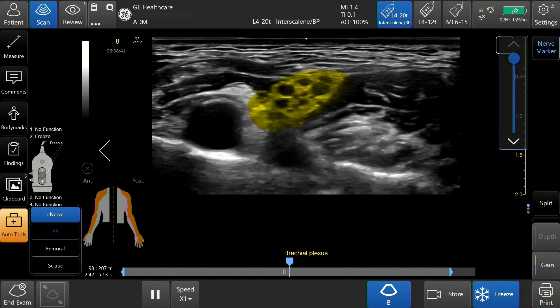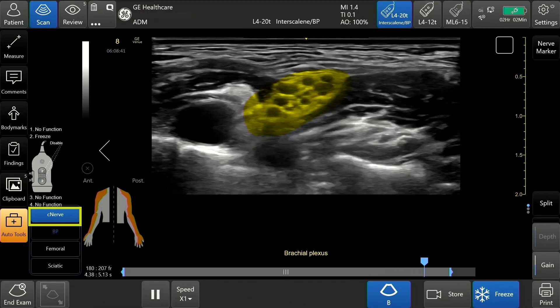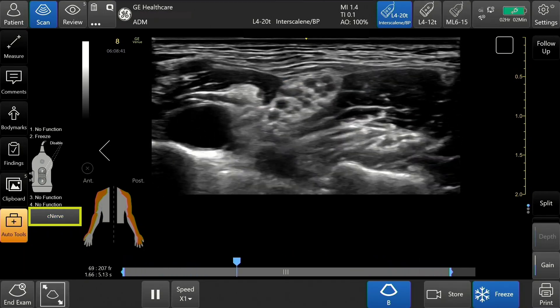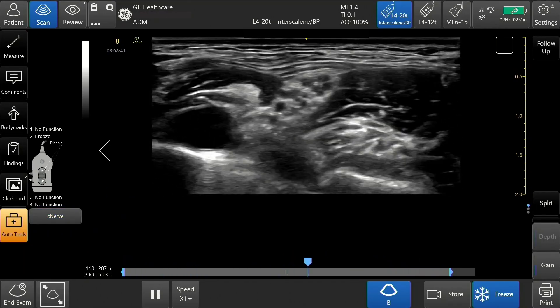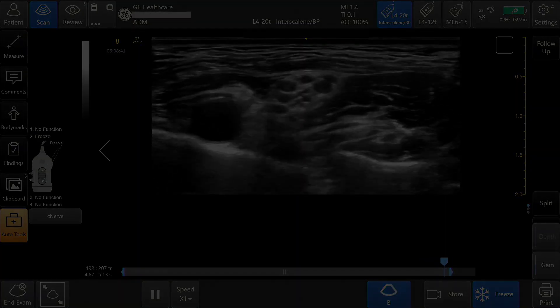To exit C-Nerve, tap C-Nerve or tap C-Nerve using the programmed probe button.